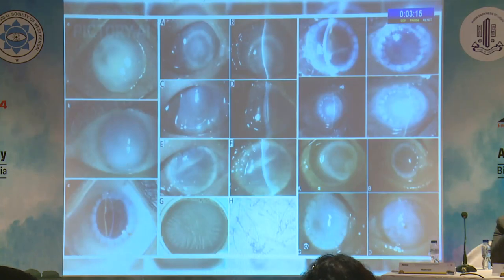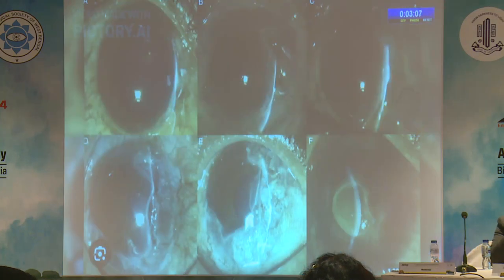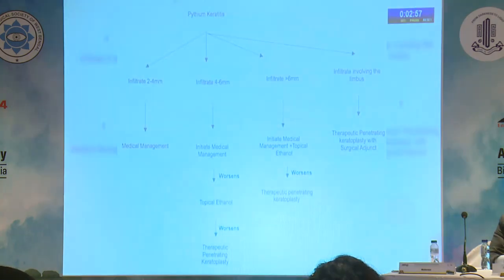But often surgical intervention like therapeutic and tectonic keratoplasty is mandated for severe non-resolving cases. Adjunctive treatment techniques like cryotherapy with ethanol and the use of cyanoacrylate glue with bandage contact lenses are employed for better outcomes and to prevent recurrence. Postoperative management is critical for recovery and good outcomes in these cases.